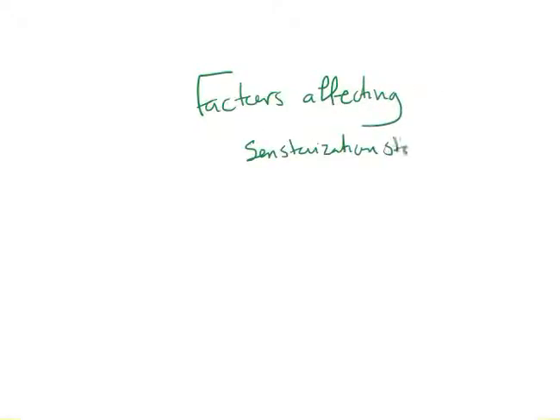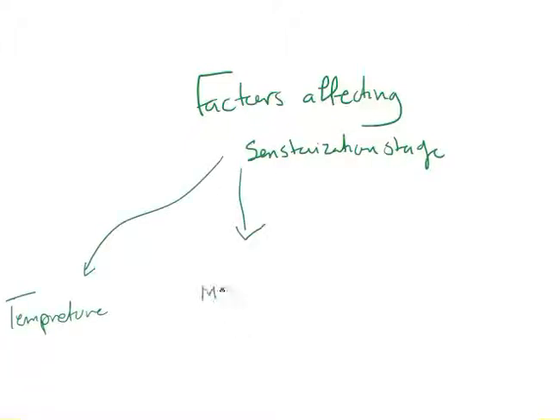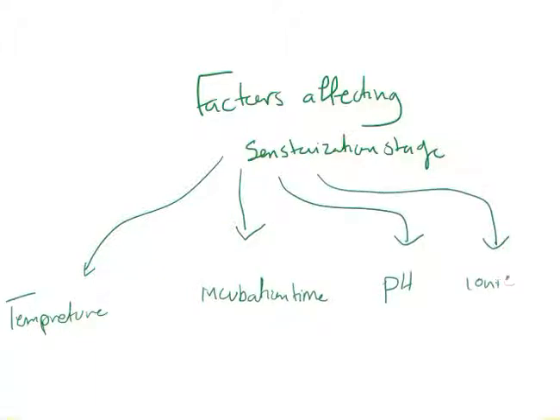We just explained the sensitization process, and now we will talk about factors affecting this stage. We will talk about temperature, the incubation time, pH of the environment, and finally we will talk about ionic strength and how it affects. Let's talk now about temperature.